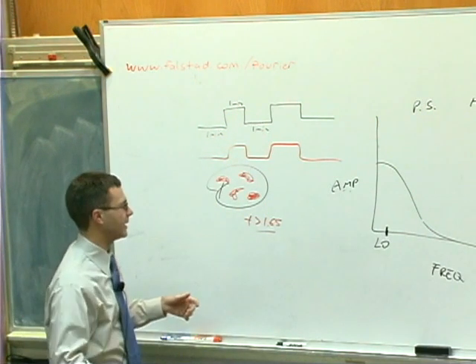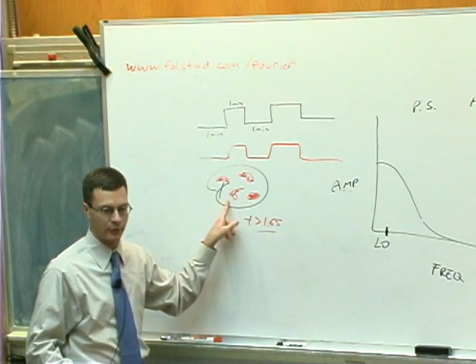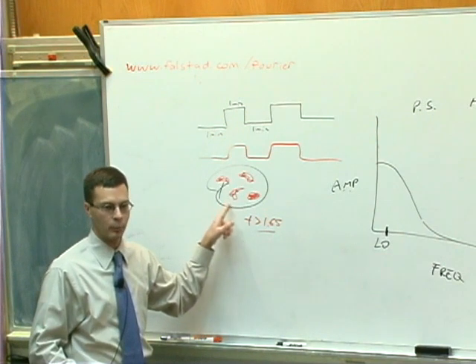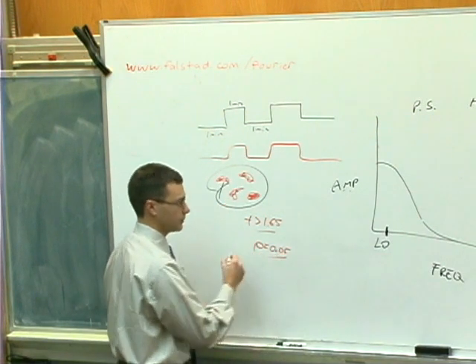Let's hold that idea. How about just purely from a mathematical standpoint? I took this statistical map. It's got 20,000 voxels in it. In each voxel, I threshold, and I said, put a red dot there if the t was greater than 1.65, which corresponds to a p equals 0.05.